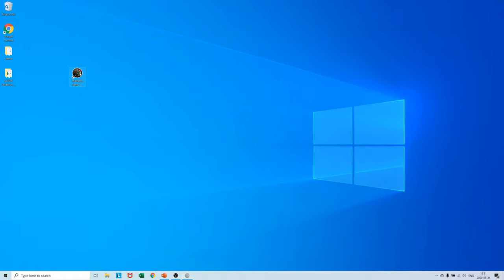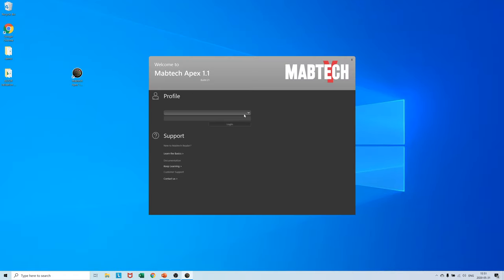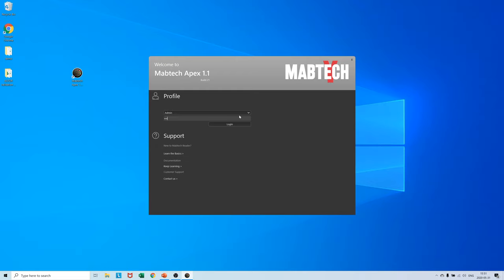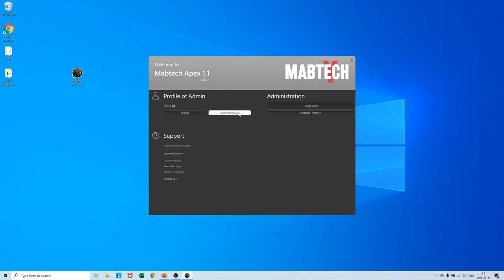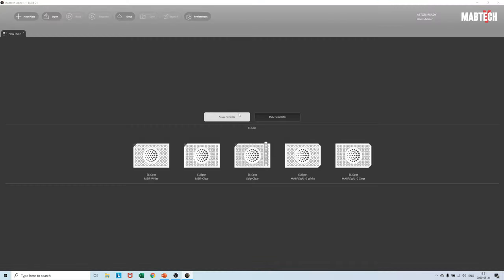We initiate our session by double-clicking on the Mabtech Apex software icon, logging in to the admin profile in the welcoming window, and then under new plate selecting the Elispot assay principle of our choice.